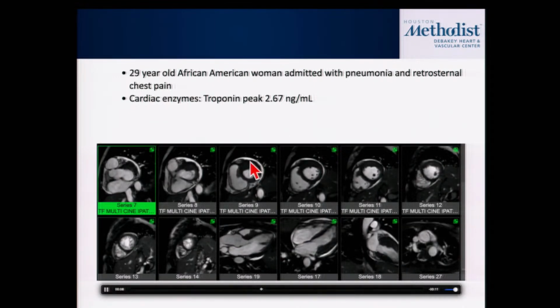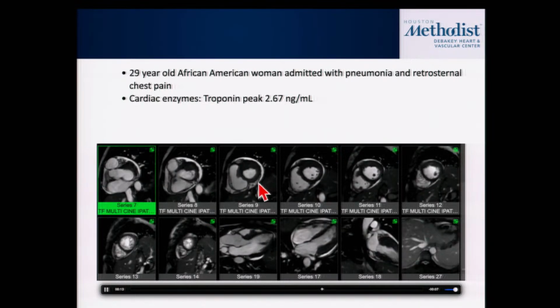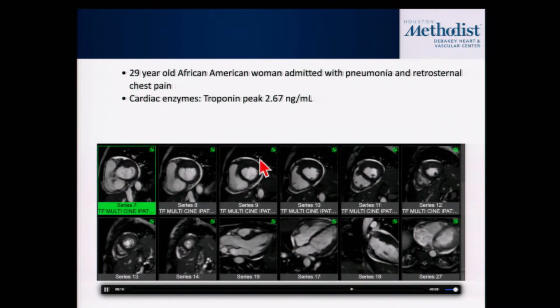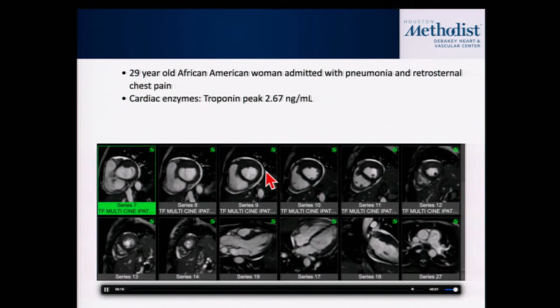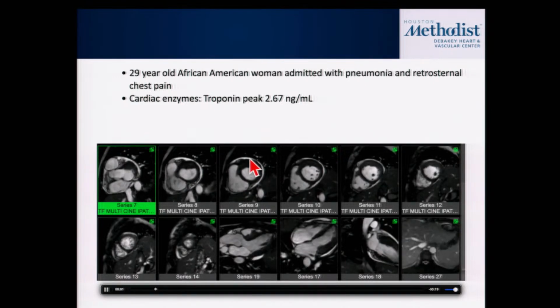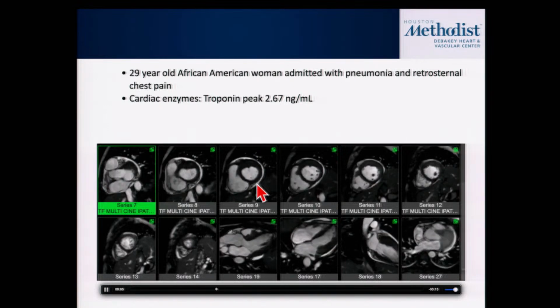Okay, so this is not so much the pericardium as it is a pericardial effusion. This bright that you see here, because again, the pericardium would be unusual for it to be this extremely thick, right? And also when you see this bright, that's fluid. So there's a pericardial effusion. What else? Very good.